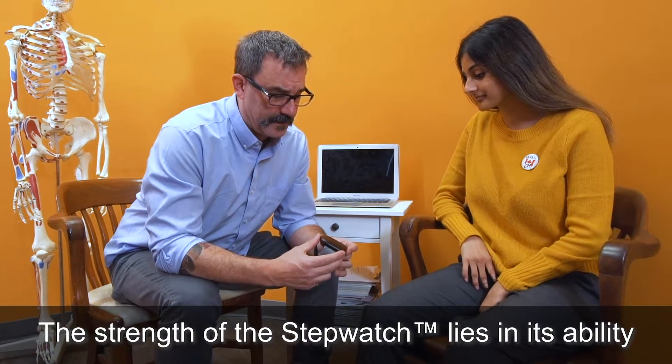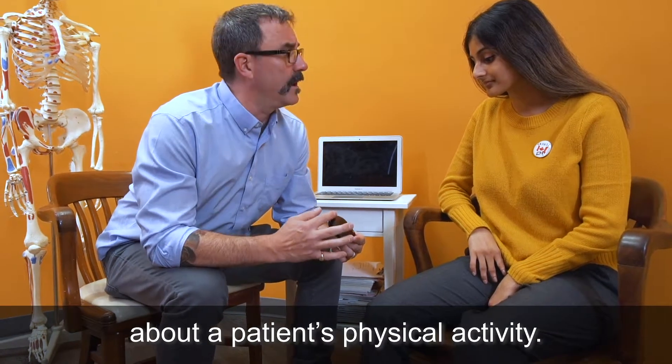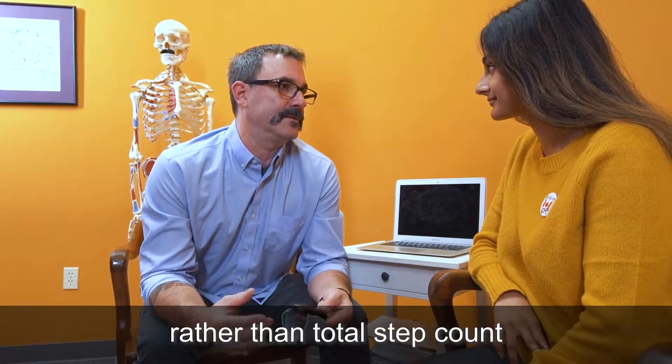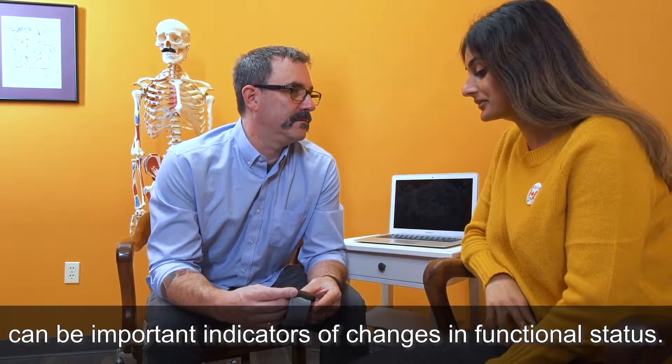The strength of the StepWatch lies in its ability to provide objective clinical information about a patient's physical activity. It has been found that patterns of activity rather than total step count can be important indicators of changes in functional status.